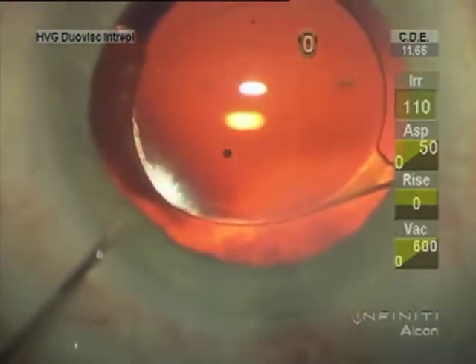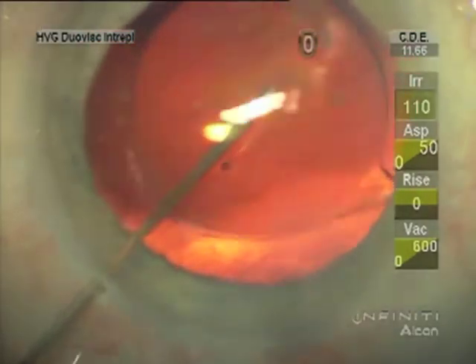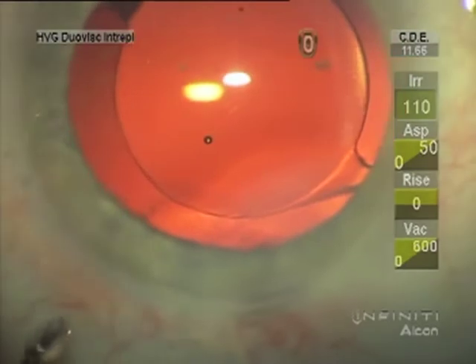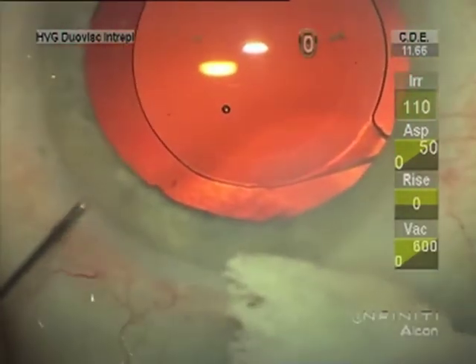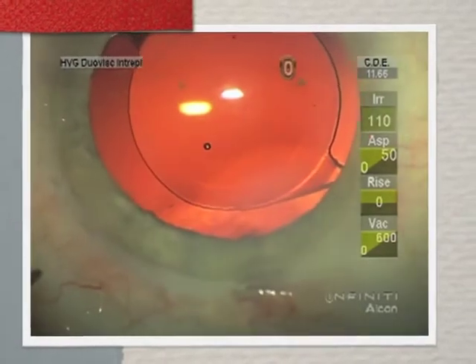With vancomycin I nudge the lens until I can get under it with just a little flow of the vancomycin — one milligram in 0.1 ml concentration — then make sure the chamber is restored to normal pressure. I again check the wounds to make sure that they're watertight at the very end, because I think this is the most important thing to prevent endophthalmitis: making sure the wounds are well sealed.